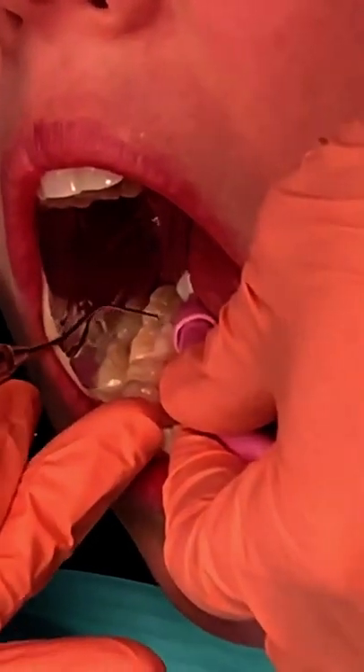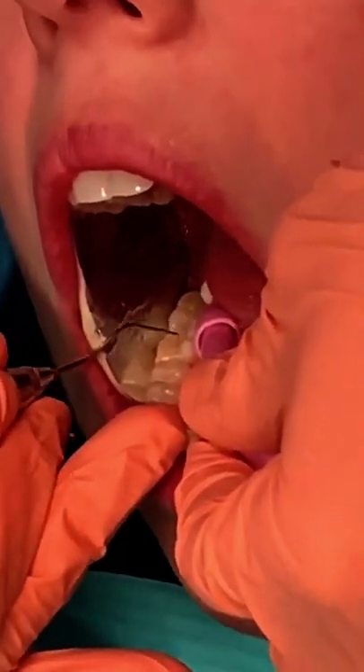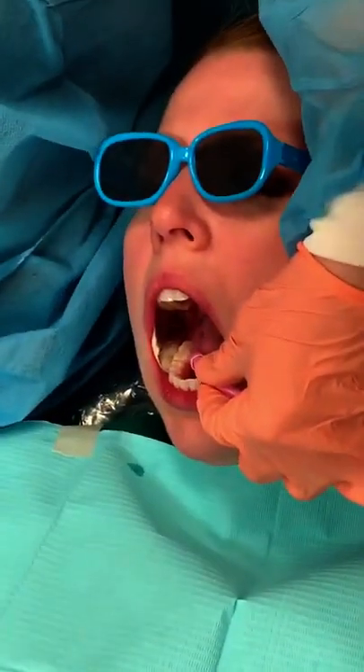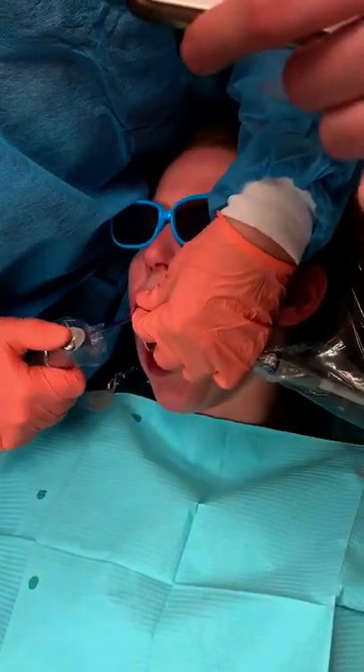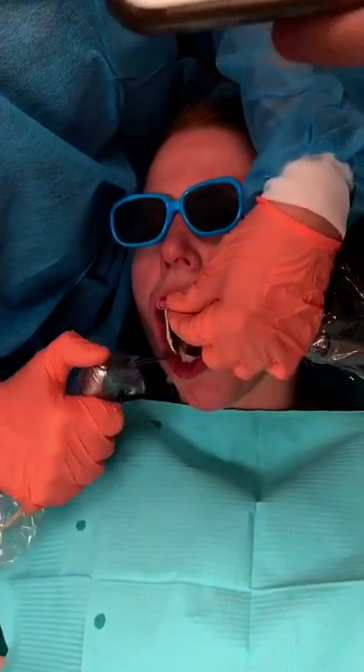I'm going to check that again — feels better this time, so it's harder. I've checked it, checked the edges, make sure it's good. I want to take a few tips and wipe off the air-inhibited layer. And then I'm going to take the isolation out. Usually the one under the tongue will come out real easily, depending on how much saliva your patient has. The dry angle may come out easily or not — hers is pretty soaked.